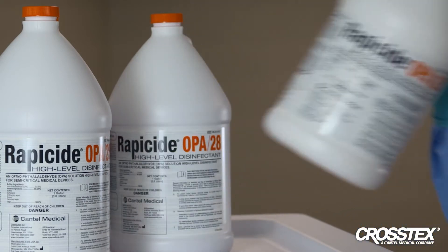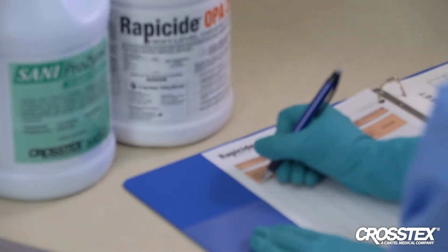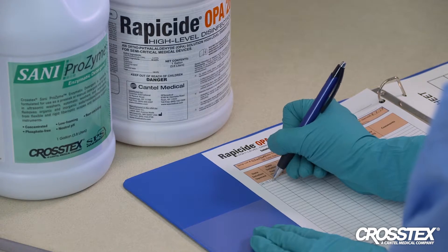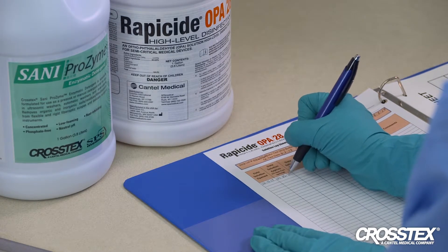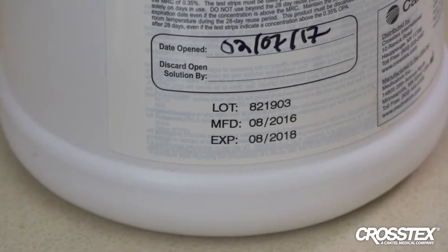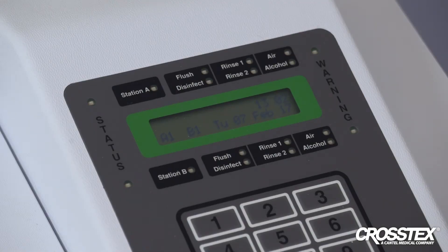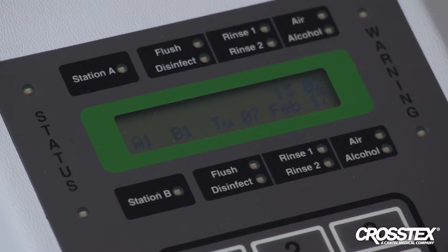Open the bottle of Rappaside OPA28 high-level disinfectant. Make sure to have the department's reprocessing log available and record the date the solution was poured on the container label or in the logbook. If any solution is remaining in the original bottle, tightly secure the cap and record the new expiration date on the bottle — the new expiration date must not exceed the original expiration date. High-level disinfection requires appropriate temperature, contact time, and length of use following solution activation. Always confirm the temperature of the solution in the holding tank is at least 20 degrees Celsius.